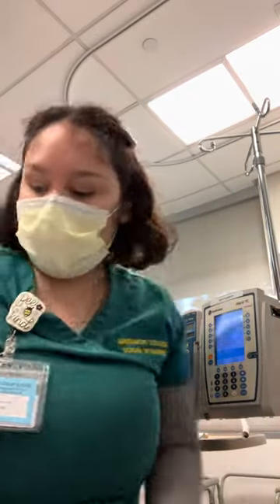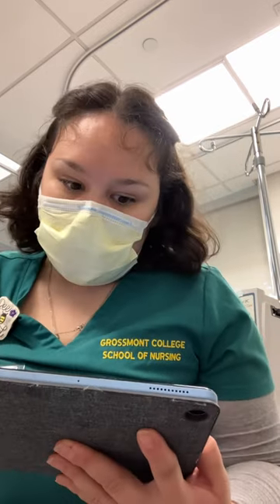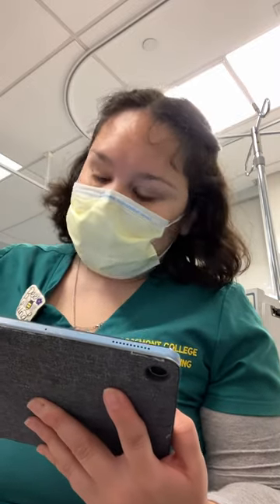I'm coming into the room and I have my MAR. I'm going to do my third check. I'm checking that I have ciprofloxacin 200 milligrams over 100 ml IV piggyback. And I'm going to check my normal saline — 0.9% normal saline, giving it 100 ml per hour, and my total volume is going to be 1,000 ml. That's good with the MAR.